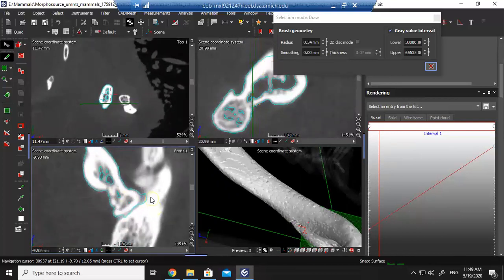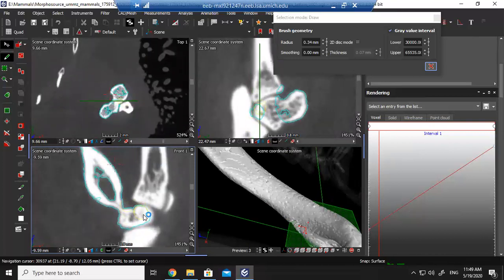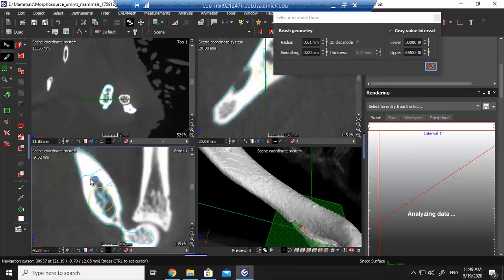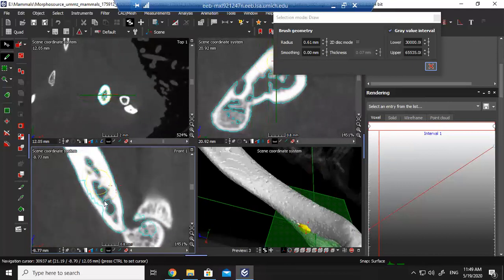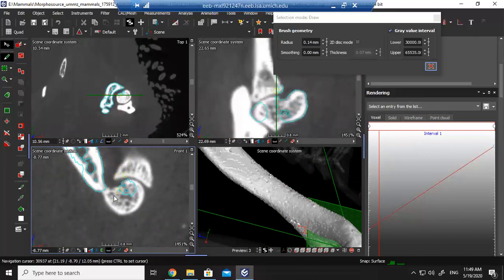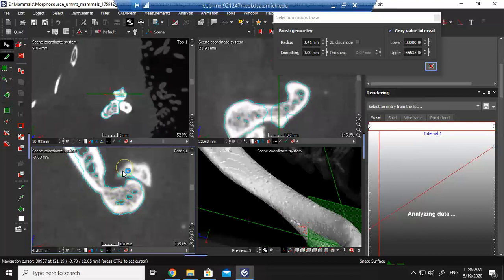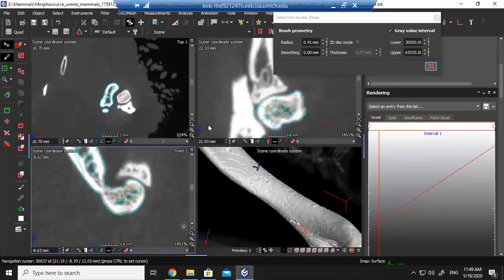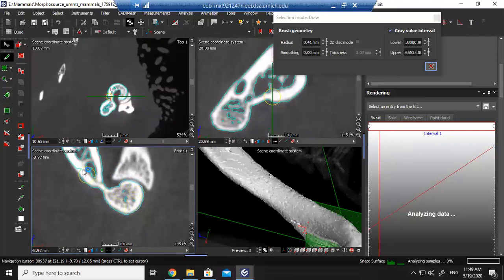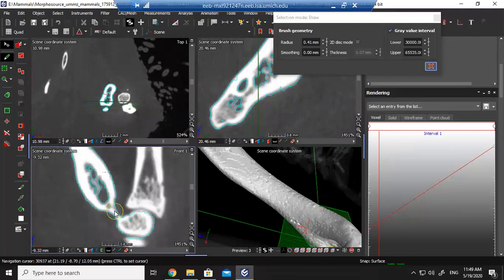And here you can see I've got a little mistake, so I'm just going to erase that. And I need to fill in this area. I'm not going to do necessarily a perfect job here, but I want to do enough so that I can show you all how to do this at home. Just going to finish that. The more of these you do, the faster you will get, but keep in mind that segmenting is a relatively time-consuming task. So it is rarely a very quick task.